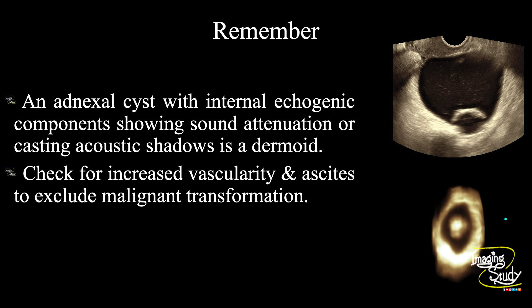Take-home message: an adnexal cyst with internal echogenic components showing sound attenuation or casting acoustic shadows is characteristic of a dermoid. Don't forget to check for increased vascularity and ascites to exclude malignant transformation.